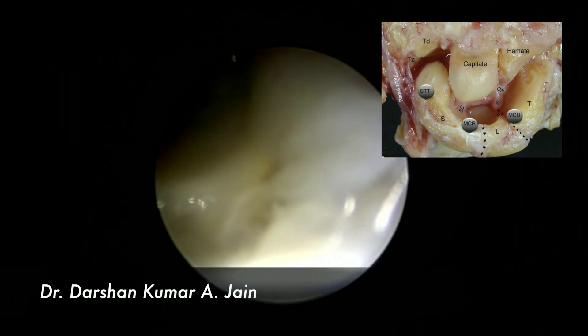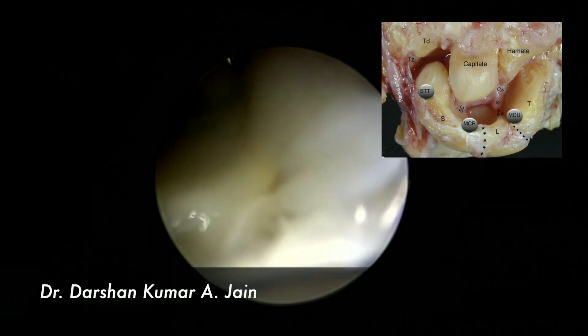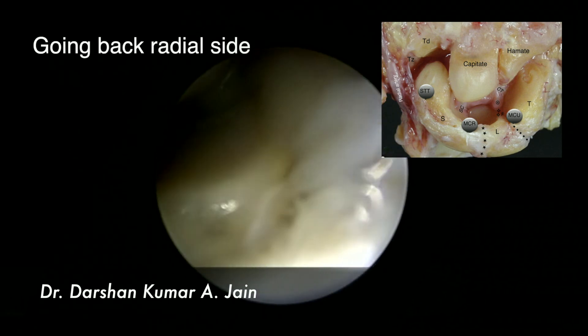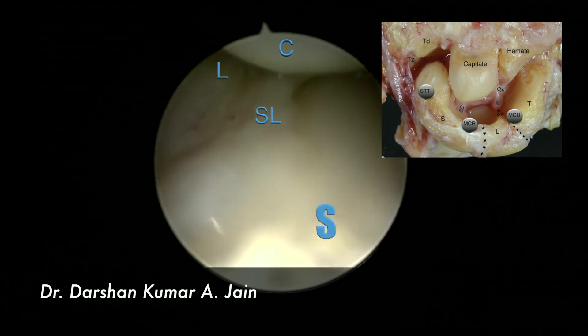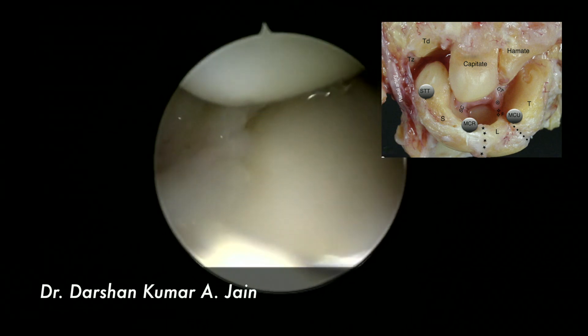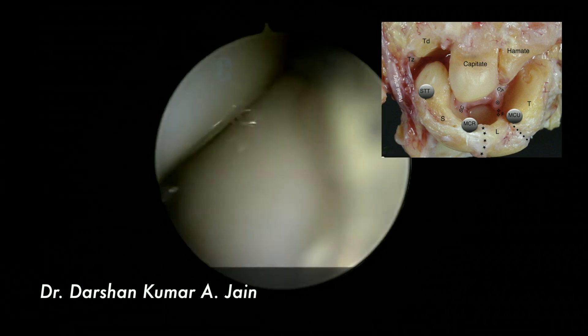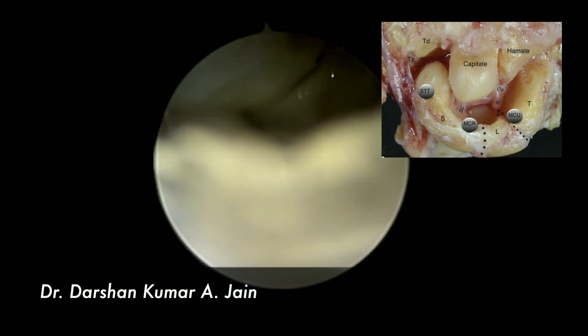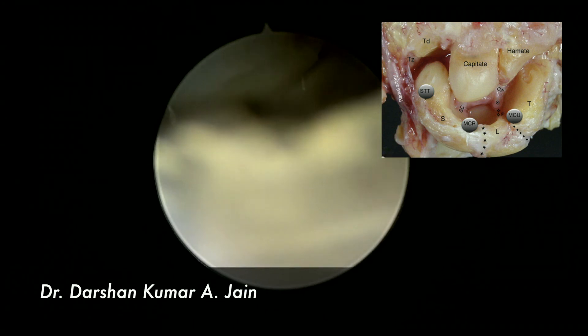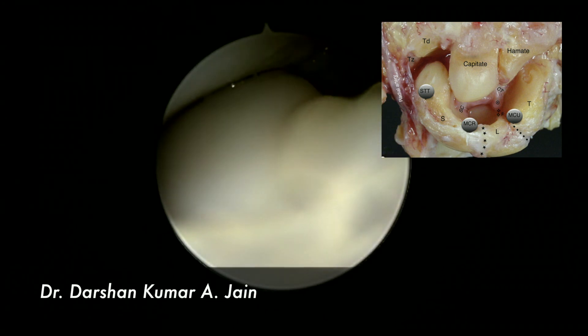And further moving radially, you can see the capitate, scaphoid, and further radially, you could see the trapezium and the trapezoid.